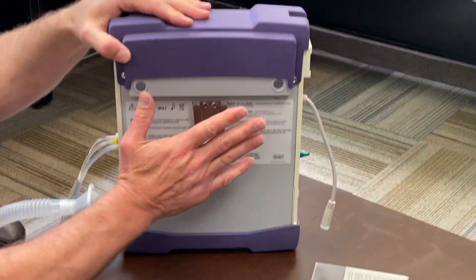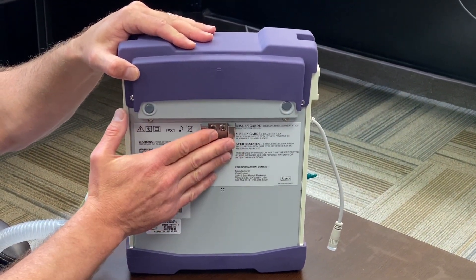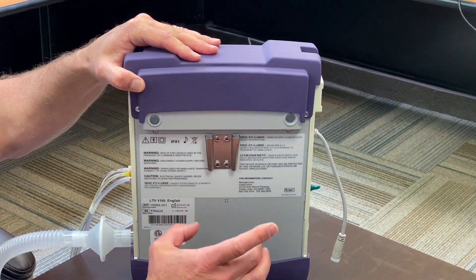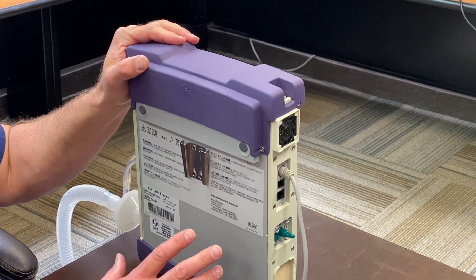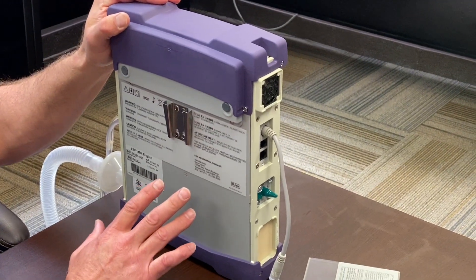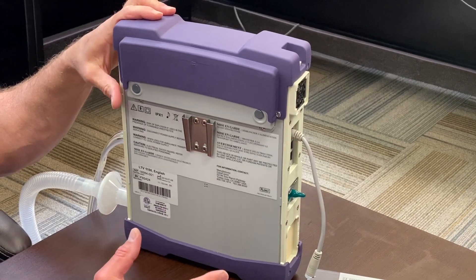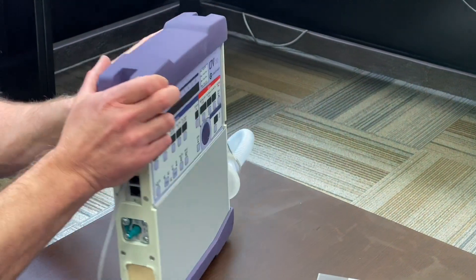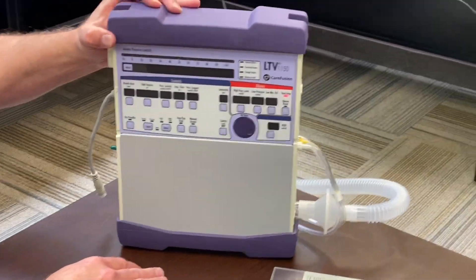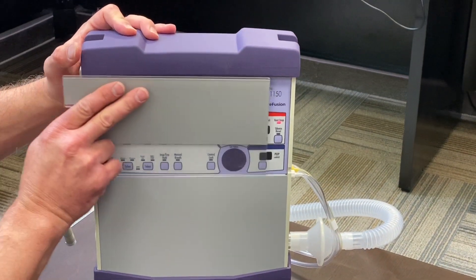On the back of the vent you have your basic setup for the base and stand. It has an accompanying part on the stand that slides into this slot. The stands I've seen with the LTV 1150 and 950 don't have rolling stands — they have a little short base, almost like a small book-reader stand.